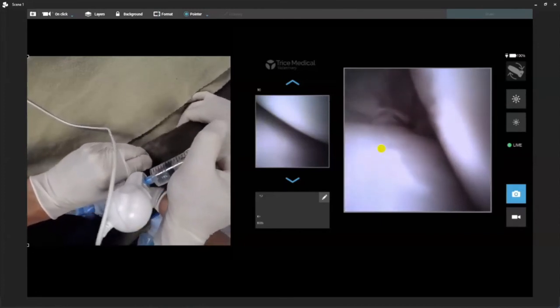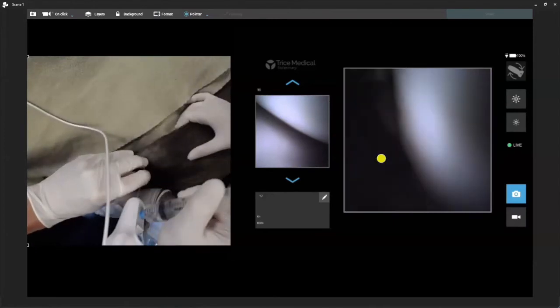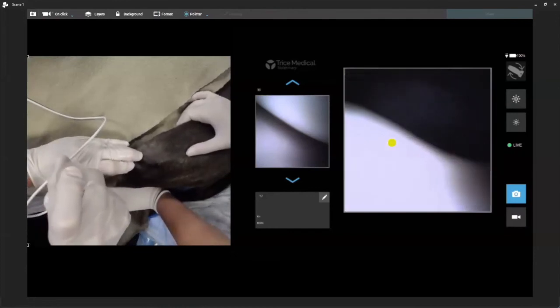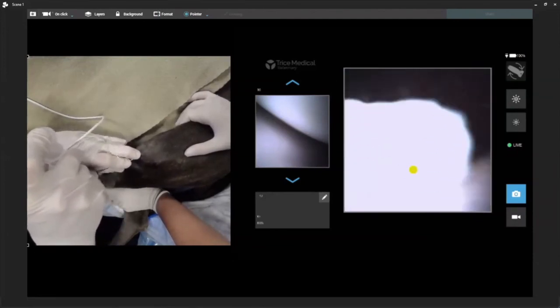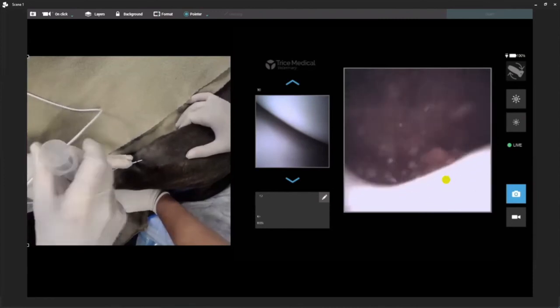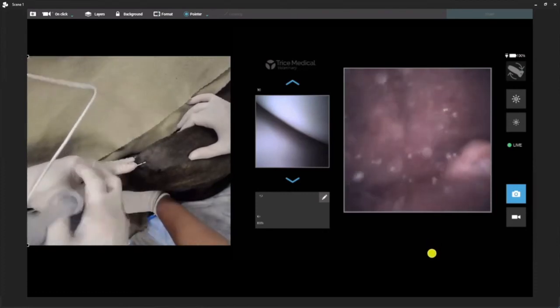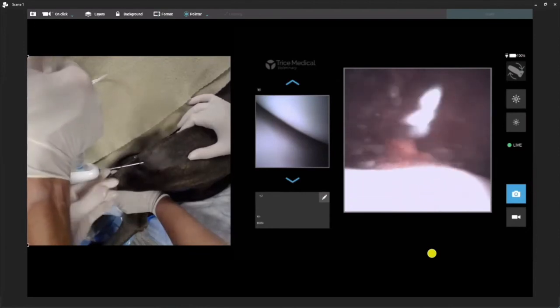Coming back to this region, we'll come back up and go all the way up the proximal pouch — there's our proximal pouch. We're going to come up and under — now we're in our patellar groove. There's going to be our trochlear groove. We can go ahead and see that. I'm going to add a little bit more fluid. Now coming down to the lateral compartment — there's the most lateral joint pouch within the stifle.